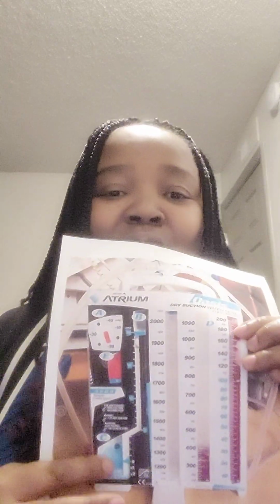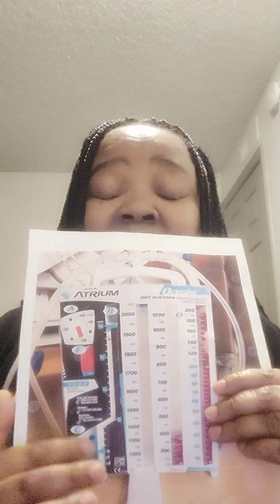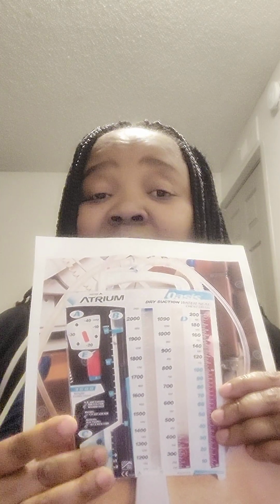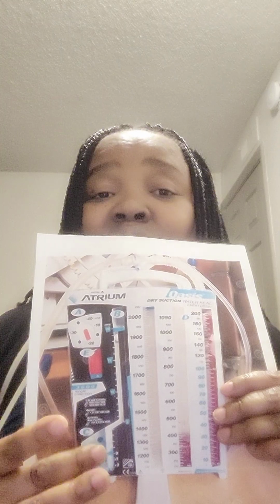So if your chest tube drainage system is working, that means that air should be coming out if it is pneumothorax. And with more air coming out, there should be more activity over here in the air leak monitor. So you will see, at the beginning part of the treatment, that there will be more bubbling here to show that the treatment is working.